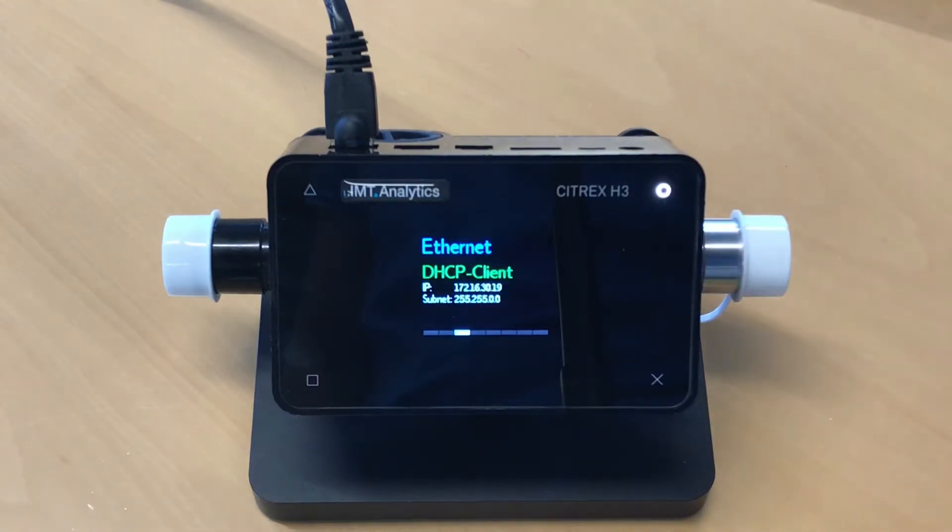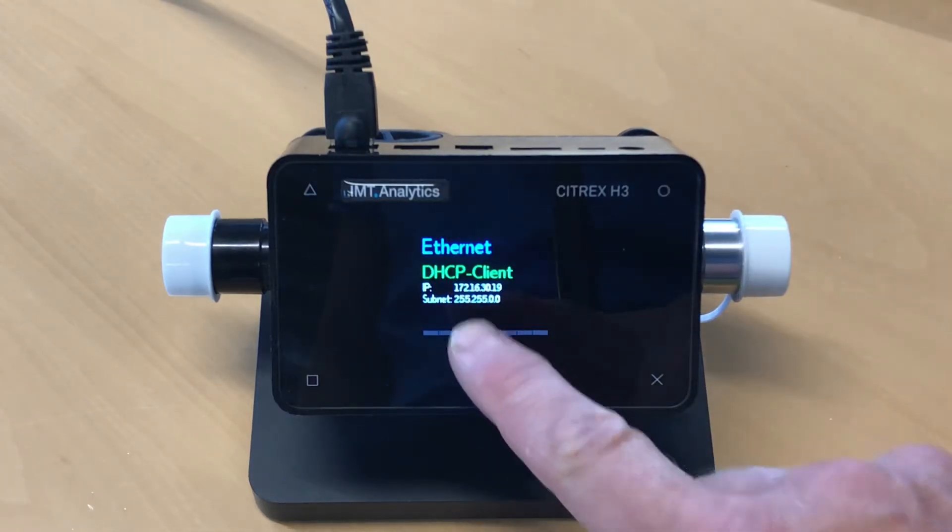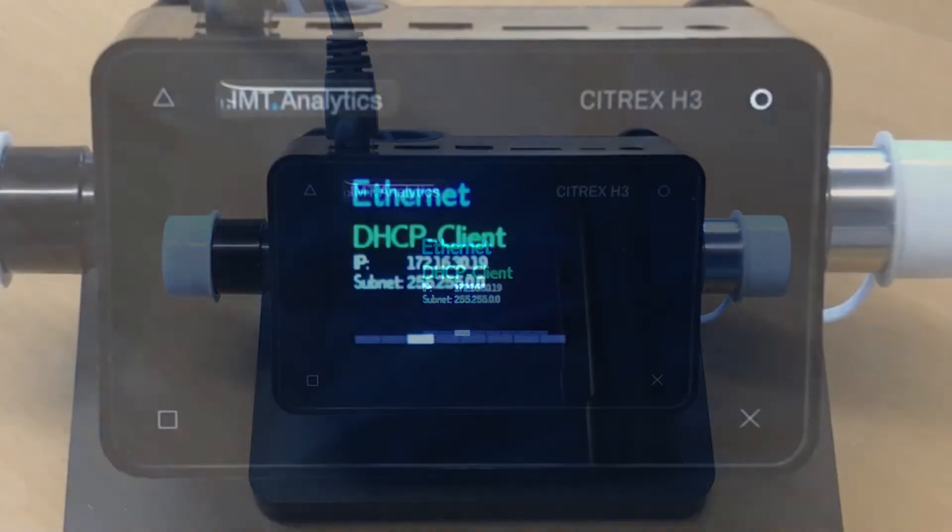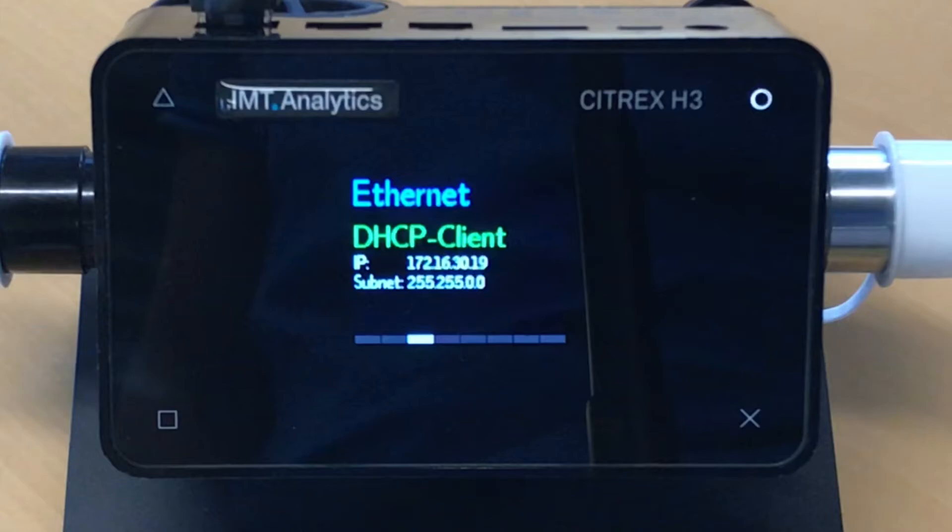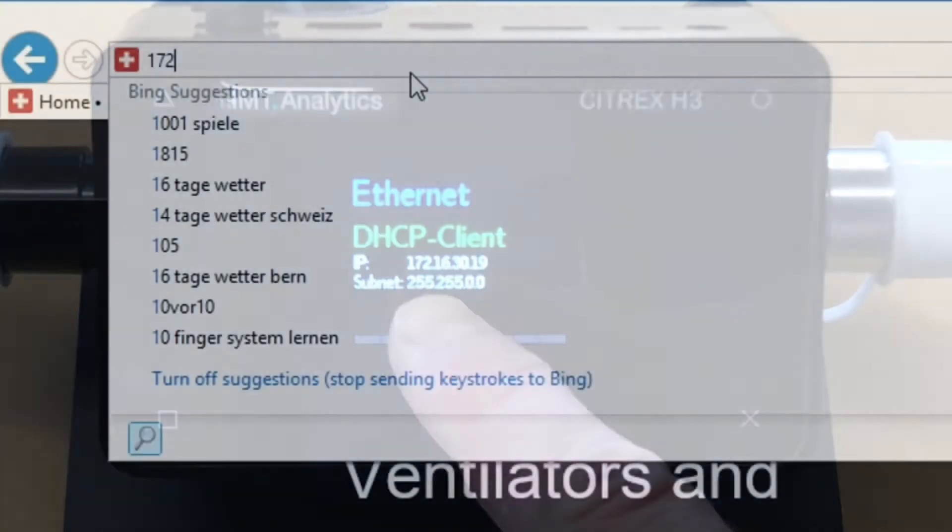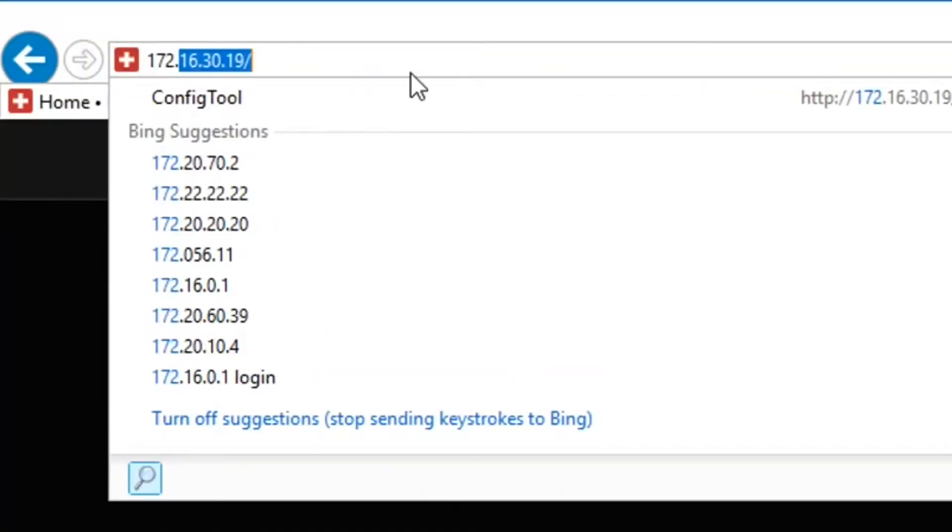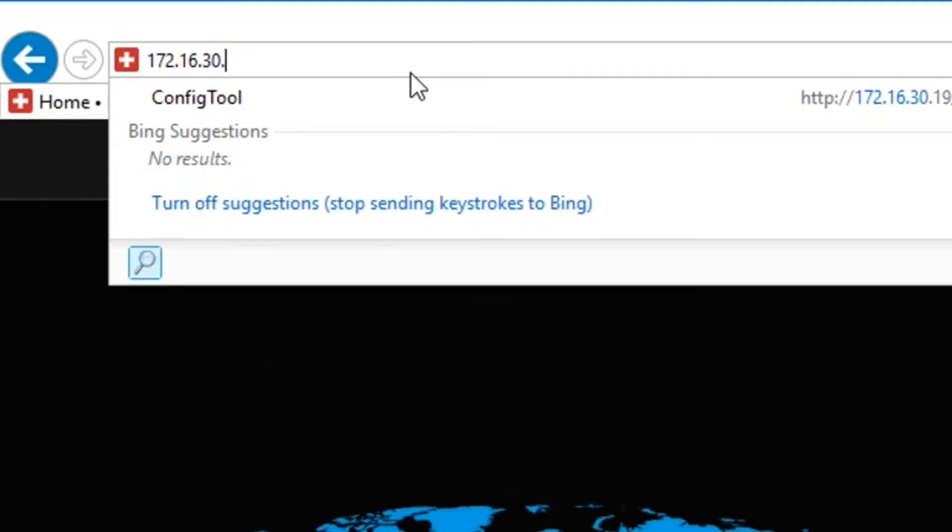You configure DHCP. The network will detect automatically an IP address which you can enter. Now open Internet Explorer.